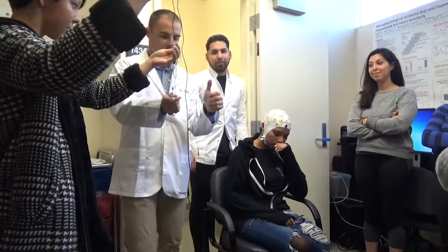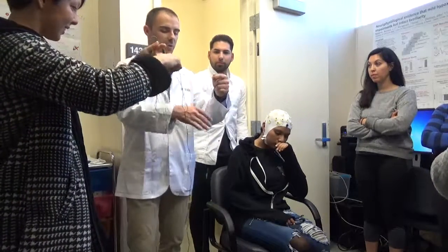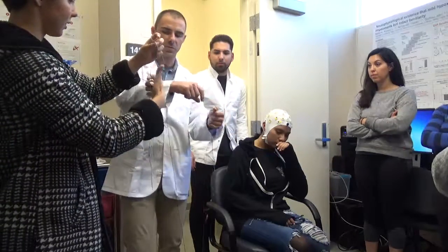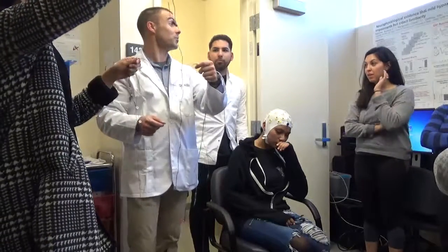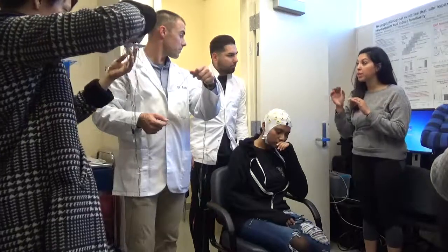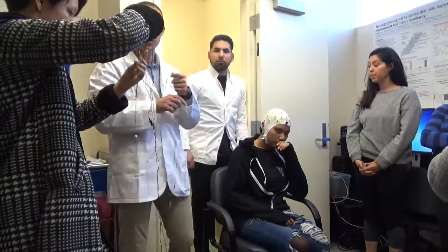Okay, so like I said, I kind of put these aside because we were jumping around between things, but like she said, we normally wouldn't do this. It wouldn't be necessary to unsort these, but I'm trying to do lots of things at once, which is why you shouldn't do that. Yeah. Is that a mesh where the gel can get onto the hair? Technically, yeah, it's just fabric, so it can definitely seep through, and that's a really good point.